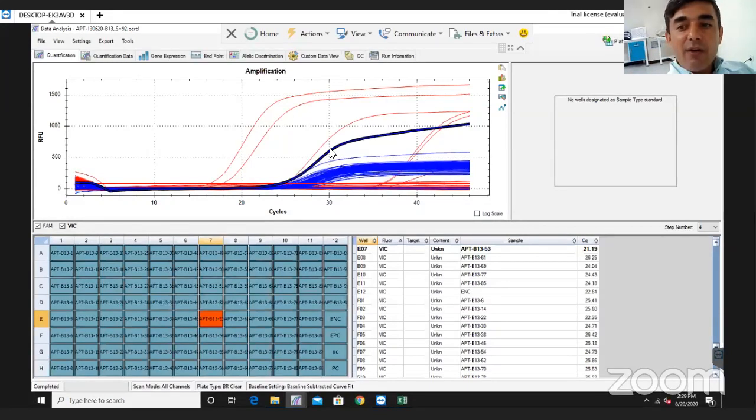How can we identify false negative and false positive results during mutations? During mutations, I will say that in particular cases, wherever you are, depending on your geographic location, if you already think that there is a mutation in that particular region, go for multiple target detection.